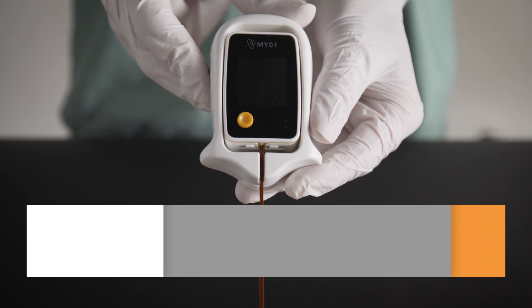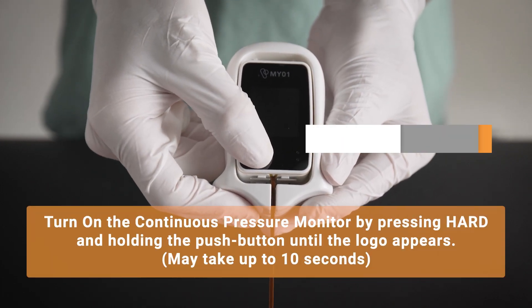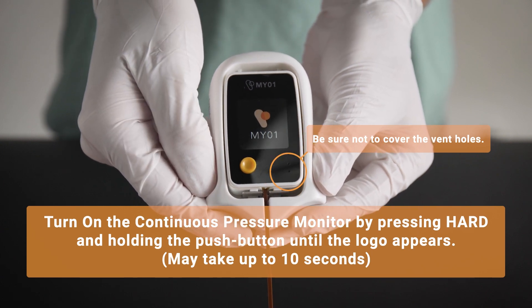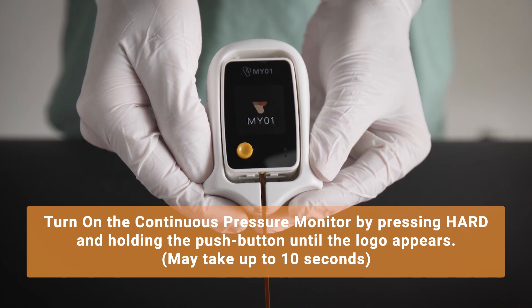To turn on the device, press and hold the orange push button located on the front of the device until the Myo-1 logo appears on the display. Make sure not to cover the vent holes. The device is now self-calibrating according to the atmospheric pressure in the room.